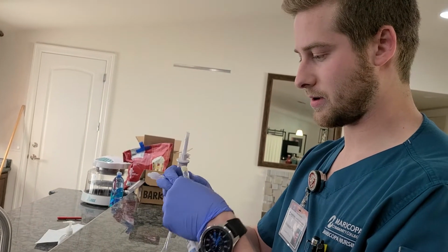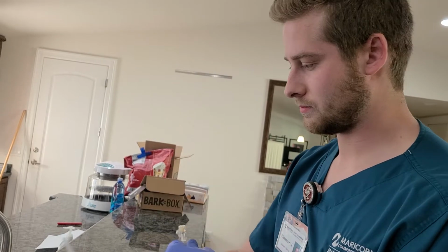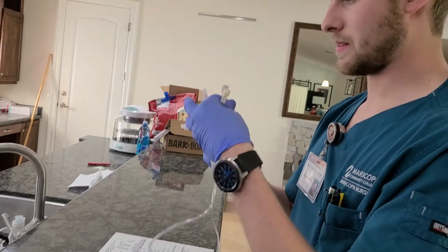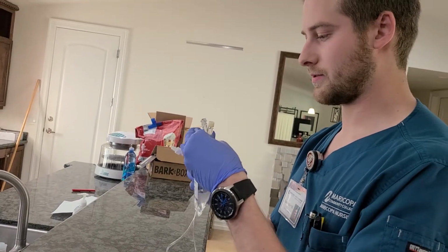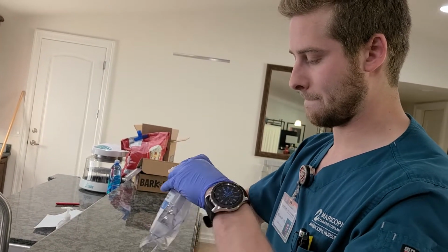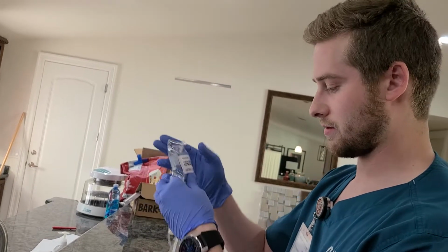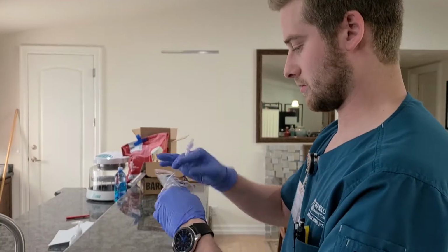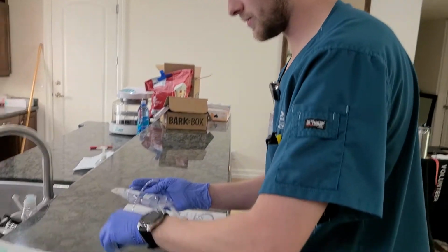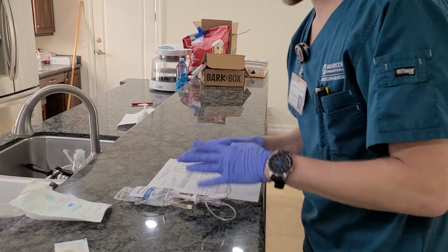We're going to take the top off here. Toss that there. Okay, we got the top off, make sure to keep it sterile. Then we're going to spike the bag. Once the bag is spiked, we're set here. Make sure to loop that there. I would make sure that I have the right tubing and that everything's good.